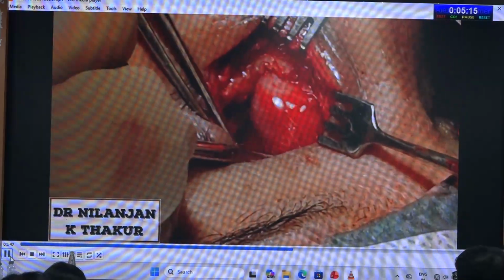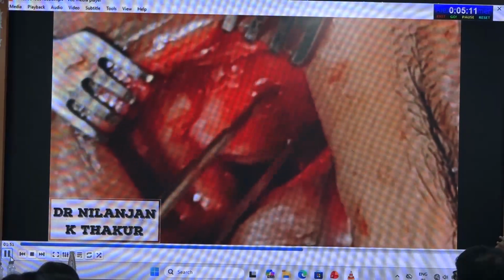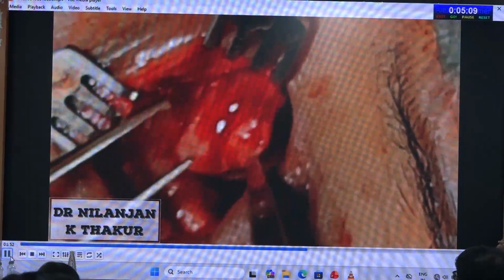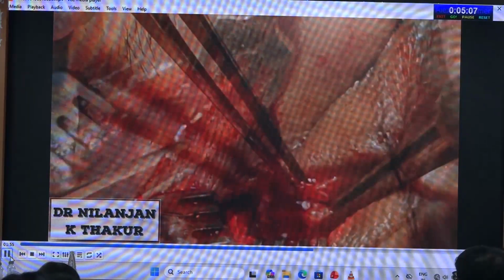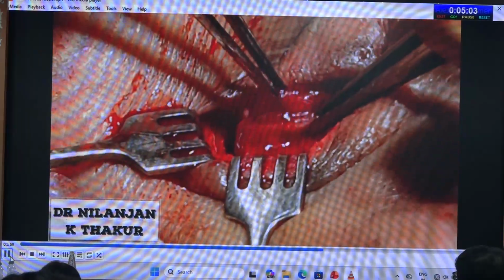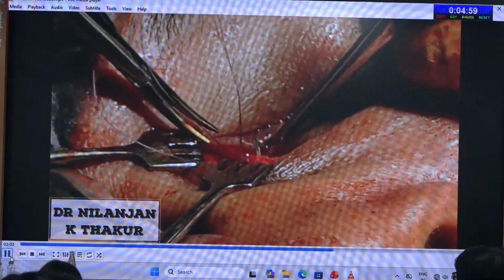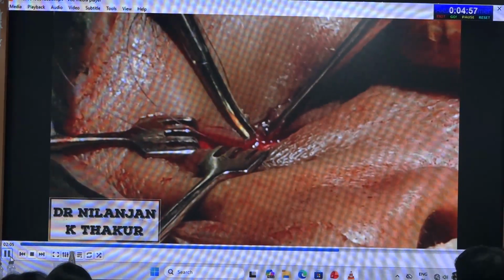You can put the incision along the bony periosteum, make a big flap, and there will be a large anterior flap and a small posterior flap. Now these are the two: one is the nasal mucosa and another is a lacrimal sac flap. Now you have to do an end-to-end anastomosis.